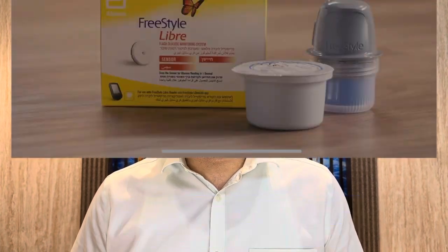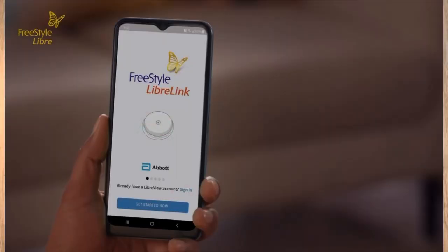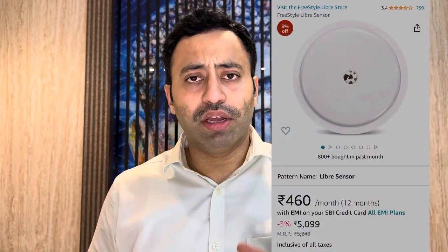Today we are going to discuss the FreeStyle Libre sensor. Right now, the FreeStyle Libre in India is available with the app — no need to buy the reader. You just need to buy the sensor, which costs around 5000 rupees on Amazon, and you need an Android phone with NFC or an iOS device — I think it's compatible with iOS 15 and above.